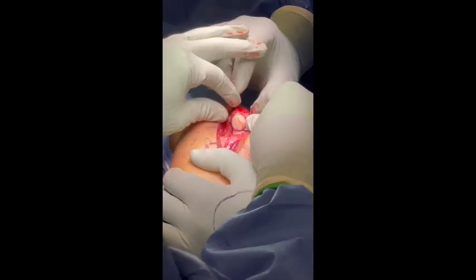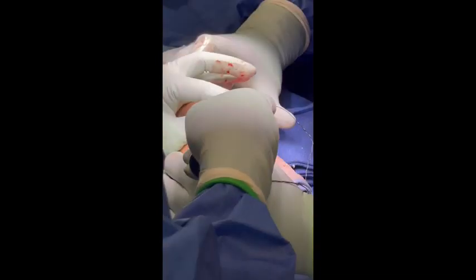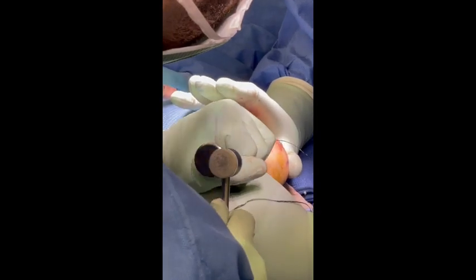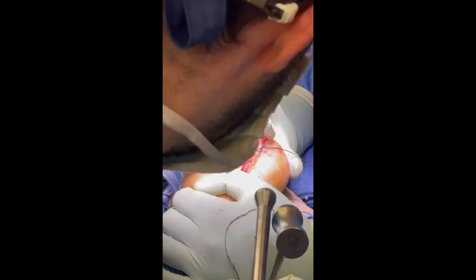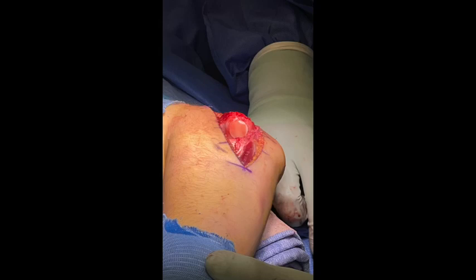in the bed of the wound so as to allow for removal of the graft if it was not positioned appropriately. The graft was hand placed until it was set and then impacted gently so as to be cautious and gentle with the overlying chondrocytes that are viable in this graft itself. Here's a picture of the final product.